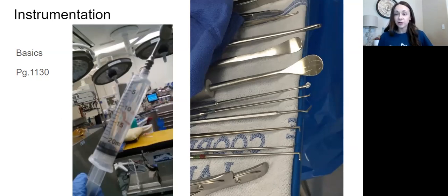So now that you've learned 2 new brain retractors, which are really fun to put together, by the way, look at your manual retractors. You should definitely be familiar with the Meyerding and the Cushing retractor. So that Cushing retractor I always had on my Mayo stand for craniotomies because we would use that to retract the muscle back as they are still drilling and taking that bone flap off. After that, you'll see other options for brain retractors. So notice that it says malleable brain spoons. So if your set or your facility does not have malleable brain spoons, they're just gonna throw malleable ribbons in there, and that is fine. So it's the same idea, they're just smaller.